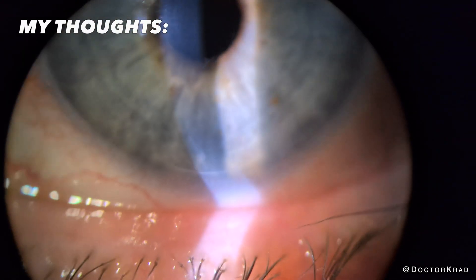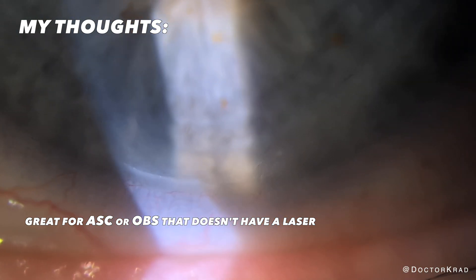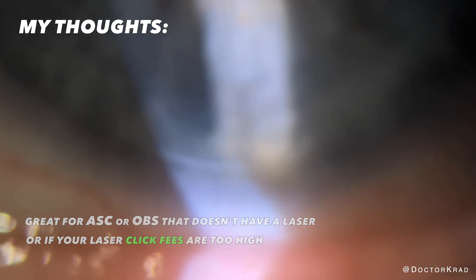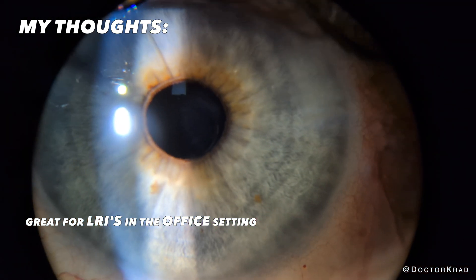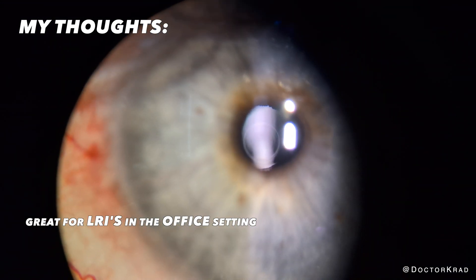So who is this for? I can see this being used in an ASC or OBS — office-based surgery — that either doesn't have a laser, or if their click fees for the laser are too high. Perhaps to treat astigmatism in the clinic. The only time I think it's a harder sell is if you already have a laser with low click fees. But overall, it creates beautiful arcuates similar to laser with ease.